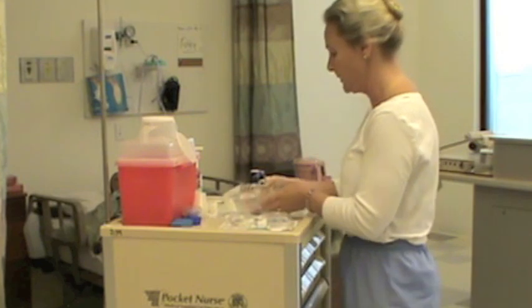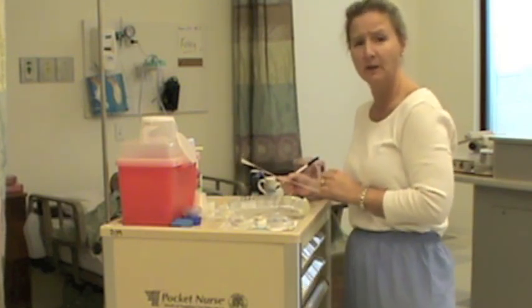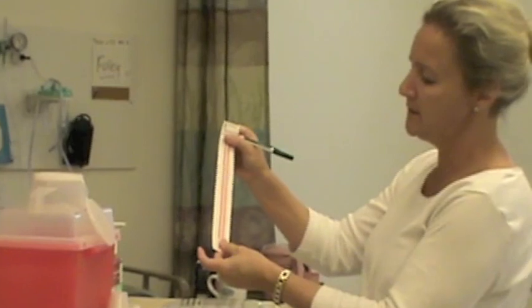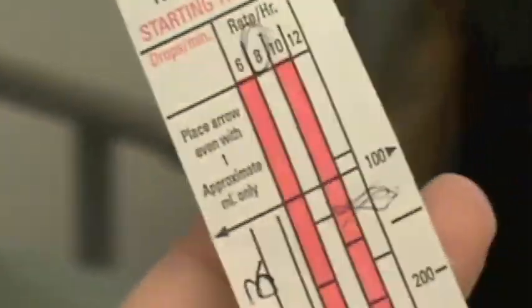Now I'm going to do my drug calculation. It comes out to 20 drops per minute — that's what I'll set my solution at. I figured that out using the rate the doctor ordered and the drop factor of 10 drops per mL. I'll label the bag with his name — Ito, Hoshi — the date, my initials, and bottle number 2. It's an 8-hour rate: 1,000 divided by 125 equals 8. I'll circle the rate per hour and mark the time lines down the bag.